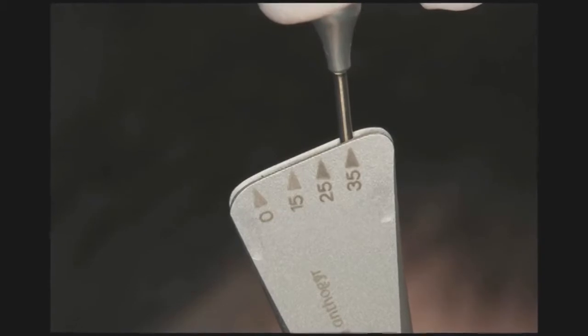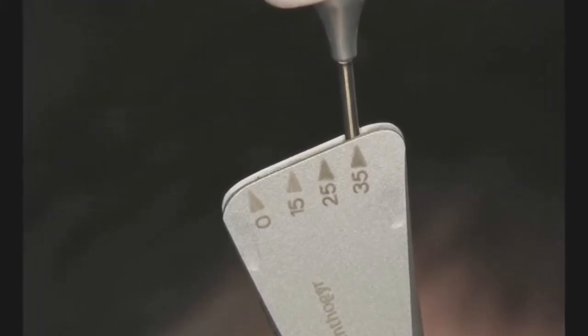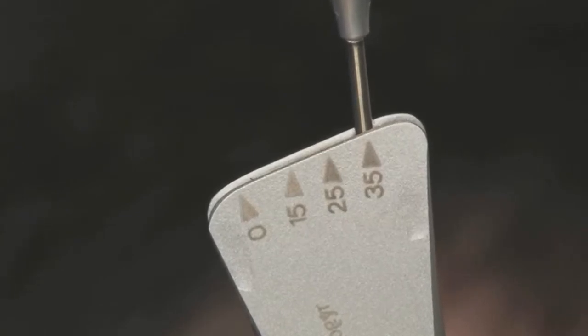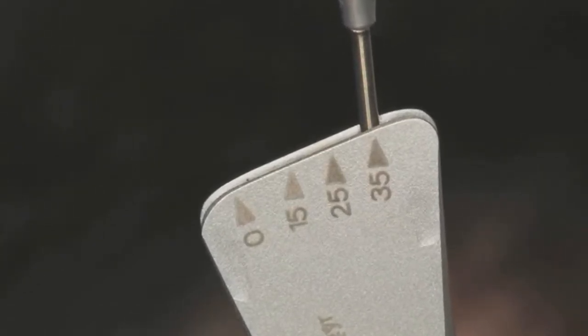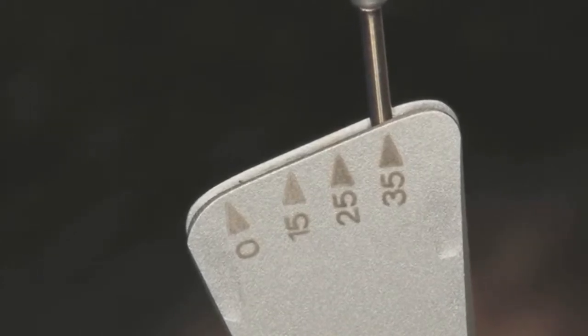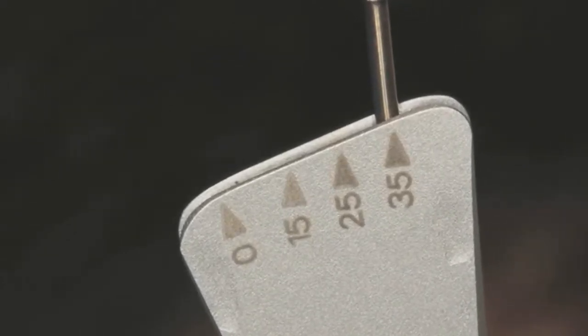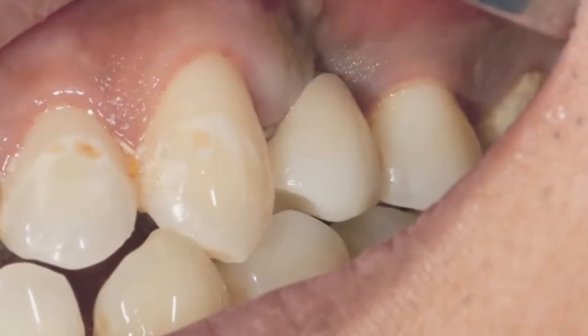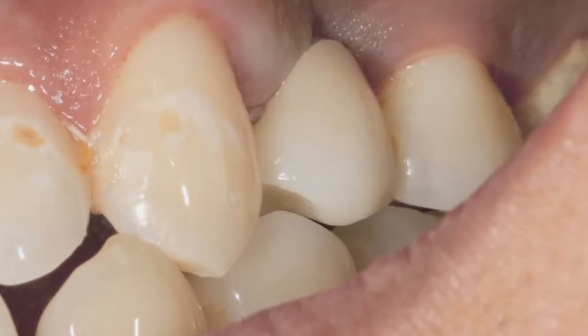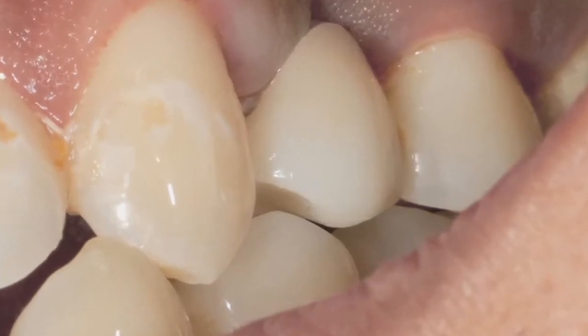It's my personal experience that if an implant can be torqued into position at the initial osteotomy time to at least 35 Newton centimeters or more, it can be predictably loaded with transitional crowns, as long as excursive contacts are removed and there's no excessive occlusal forces placed on the transitional or temporary restoration.